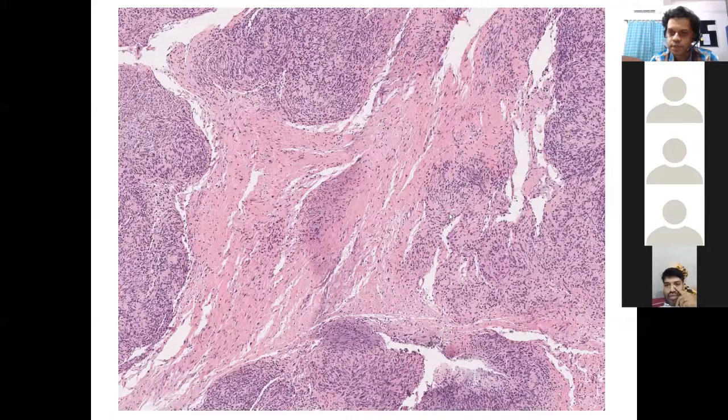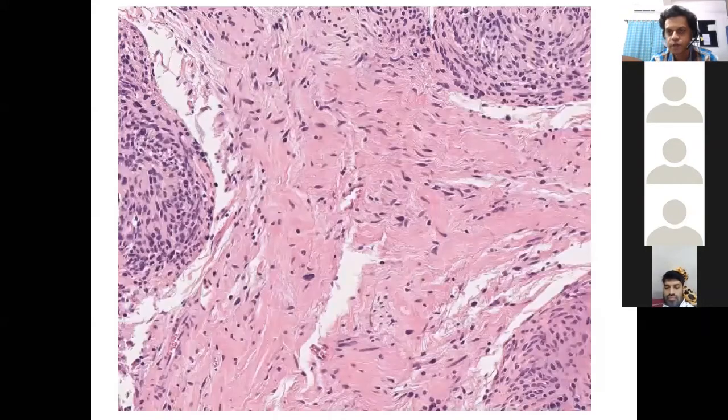Okay, so yes, sir. This is basically your plexiform nodule which has given way and the cells have spilled over into the stroma. So if you have done an S100 and you show positivity within those cells in the stroma, that also is a strong clue to the malignant process escaping from these plexiform nodules and going into the stroma. Just like in the case of a follicular lymphoma, where the cells would jump out from the follicles into the interfollicular space, like that.